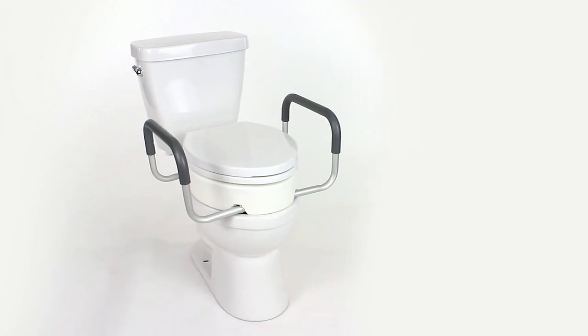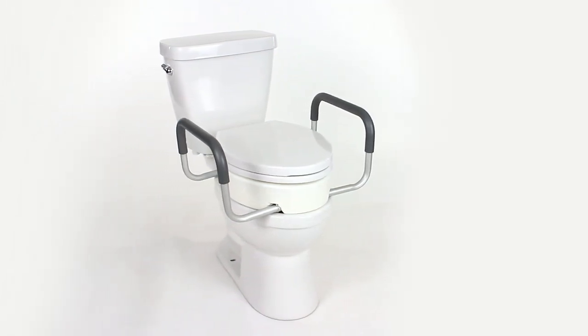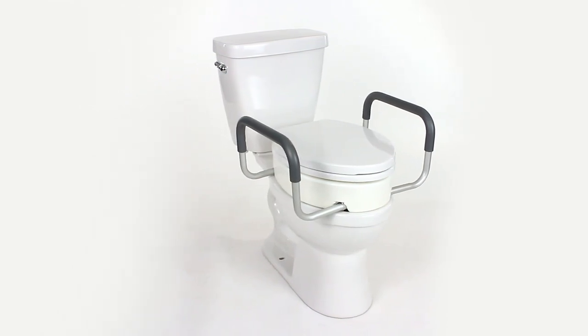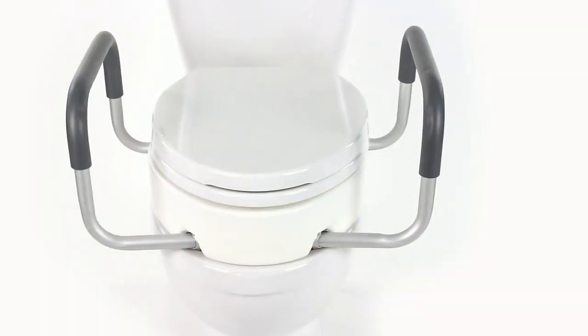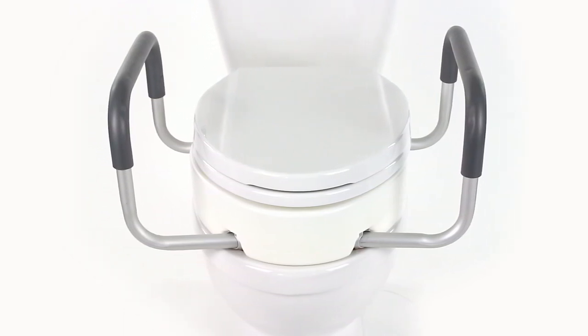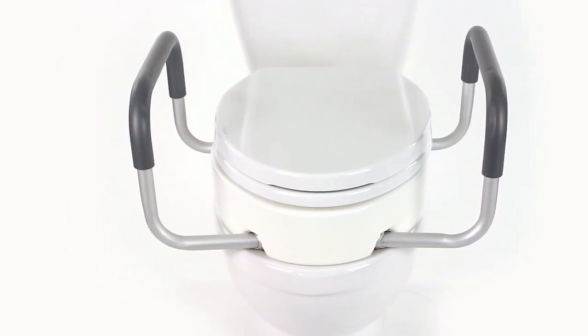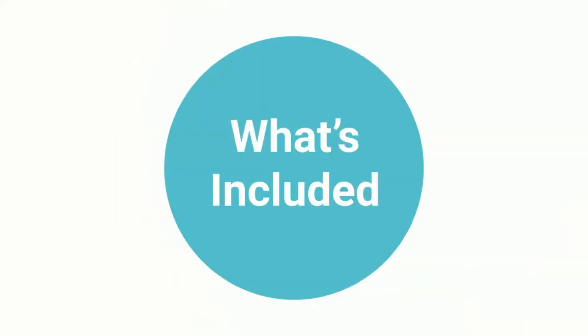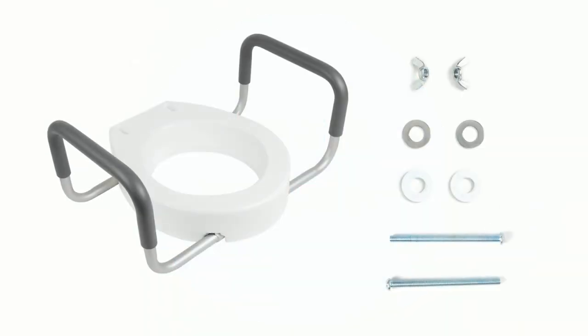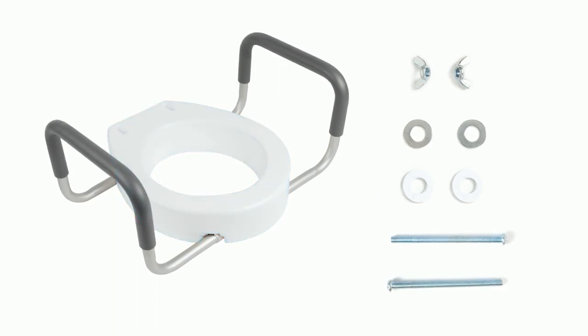This will just be a quick assembly and installation video for the Vive toilet seat riser with handles. The installation portion will be the same as with the hinge toilet seat riser, and the assembly will be the same across both the elongated and the standard round sizes.